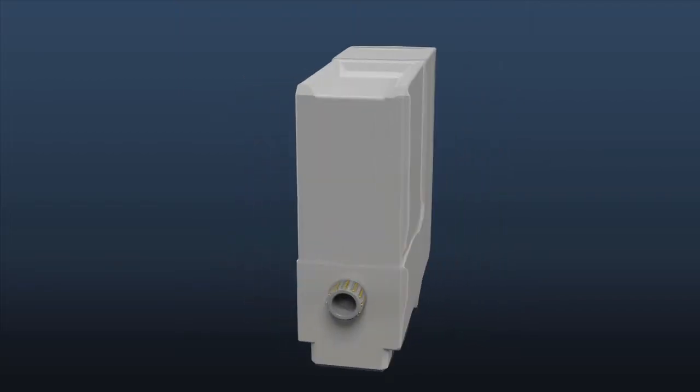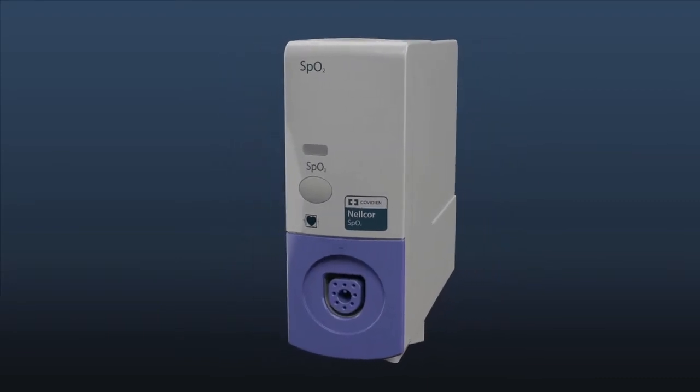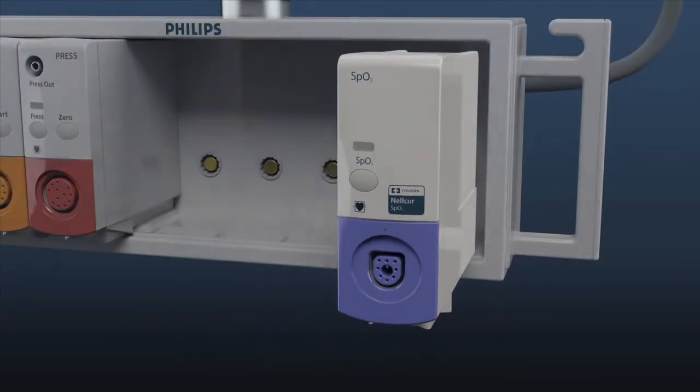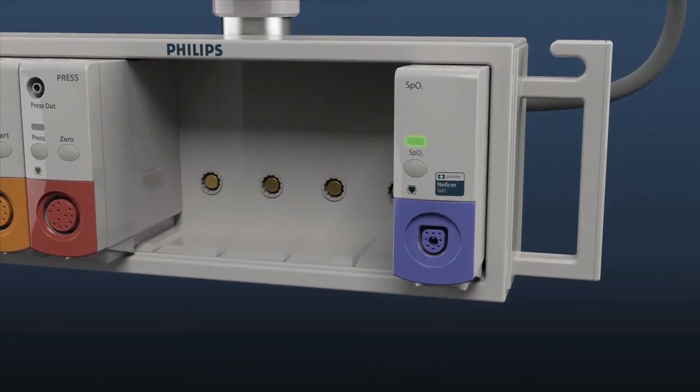Nellcor Oxymax SpO2 technology from Covidien is available in the Nellcor SpO2 single parameter module and can be integrated into a wide range of the Philips Intellivue monitors.